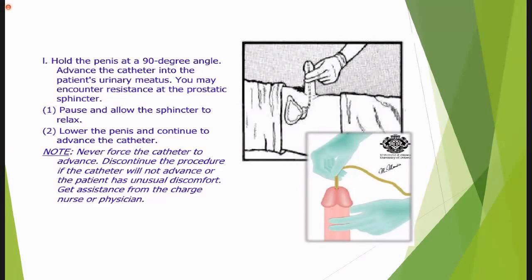Never force the catheter to advance. Discontinue the procedure if the catheter will not advance or the patient has unusual discomfort. You can immediately remove the catheter.